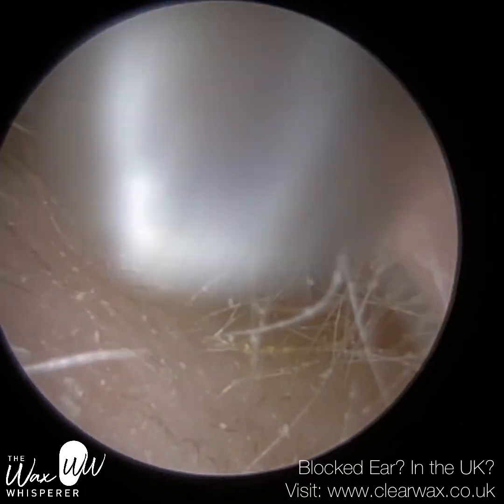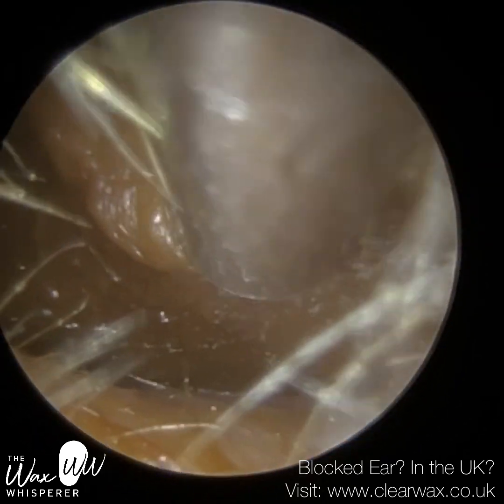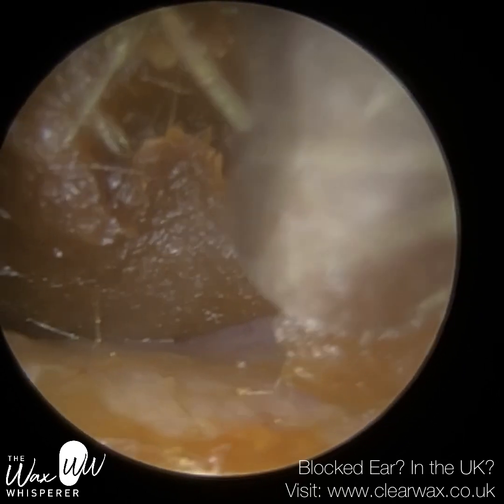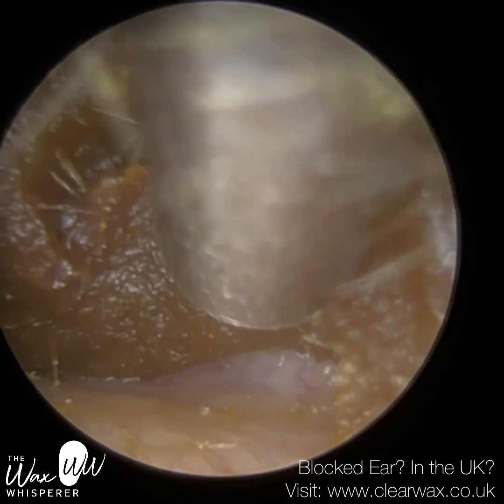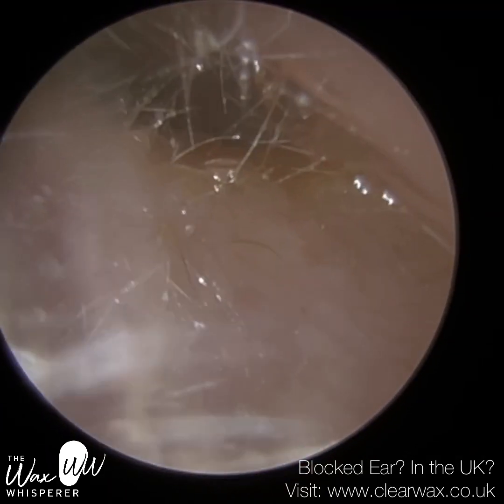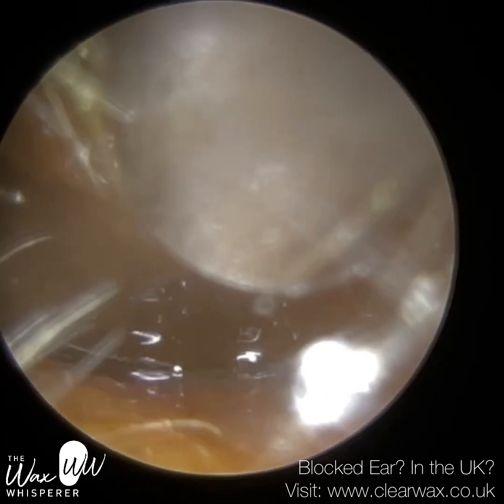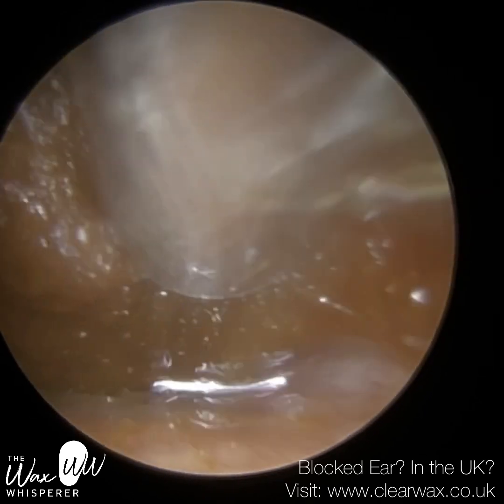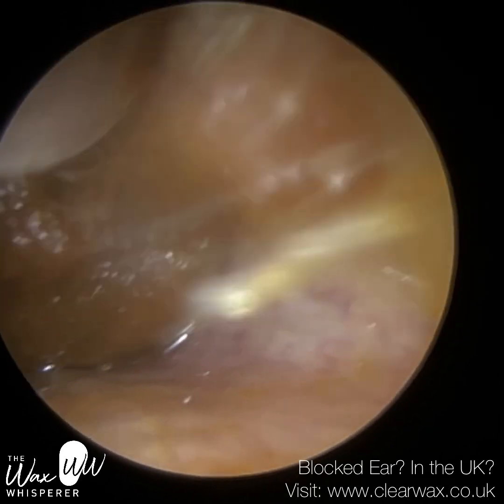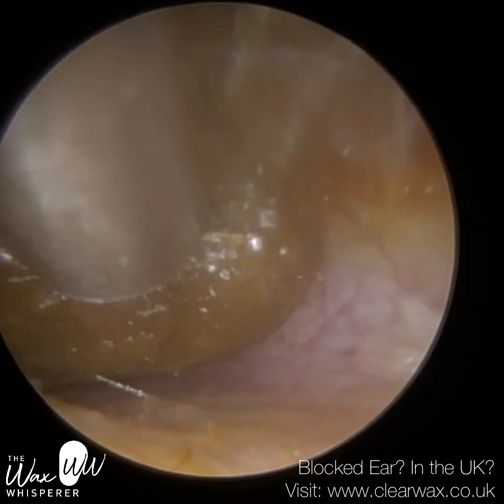So this is the patient's left ear. On both sides, actually, the ear canal entrance was slightly narrowed. Once more, this wax is very dense. It's very sticky and stodgy. It's got, again, a caramel toffee-like consistency. Without any further delay, I've just instilled the olive oil spray, and you can see just how much of a difference it makes. It really helps me to remove this plug.